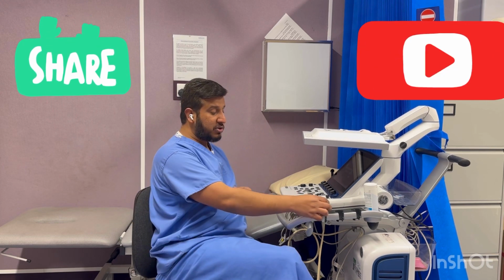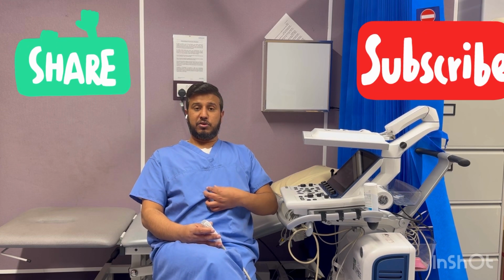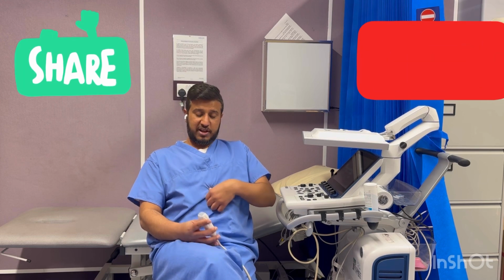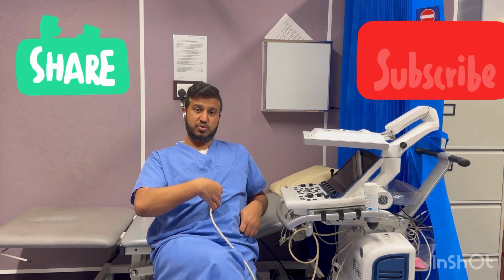Then you go into the subcostal views. Once you come into the subcostal view, you just need to mark the xiphoid area, where your sternum bone finishes. Then you press this area, the soft area, and you go into that area. Your marker is around 3 o'clock, and you do it this way.